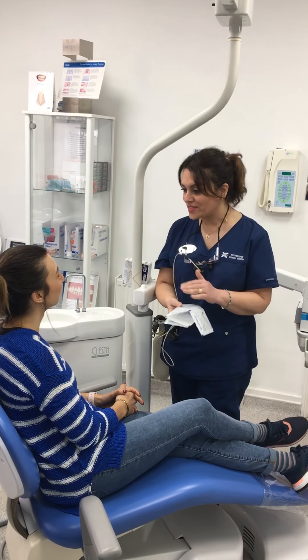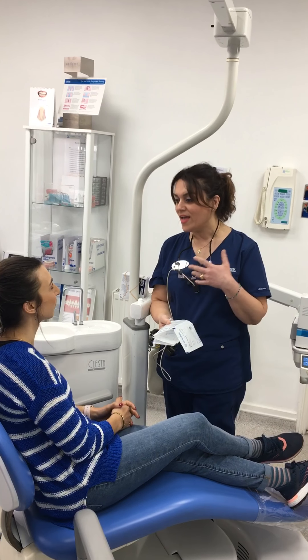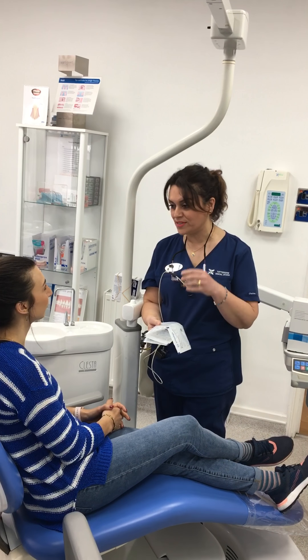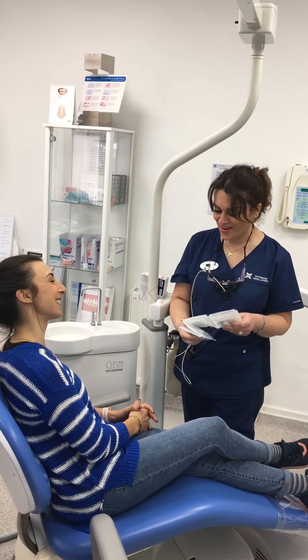We've now gone through all the stages of Invisalign, you've put your attachments on, and I've explained to you what it entails. You've seen your clean check video, and now we're all ready to give you your aligners.